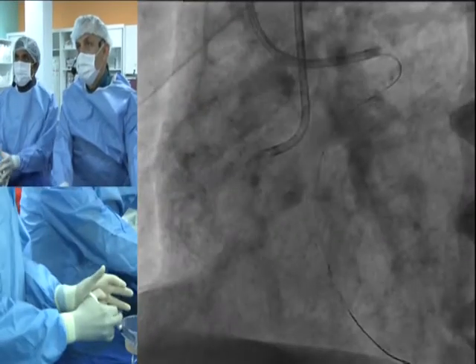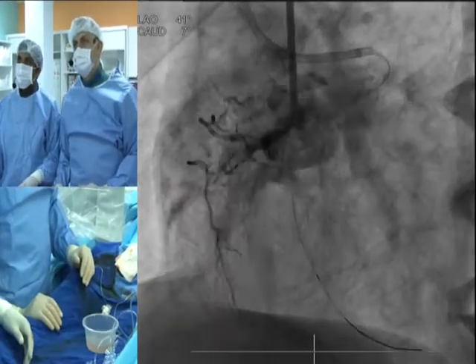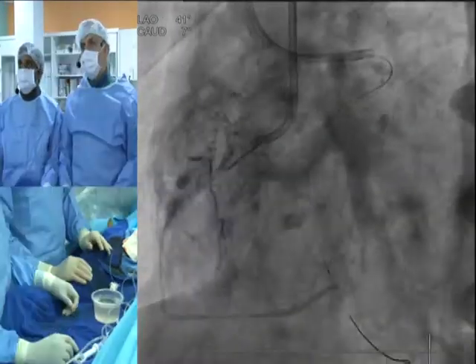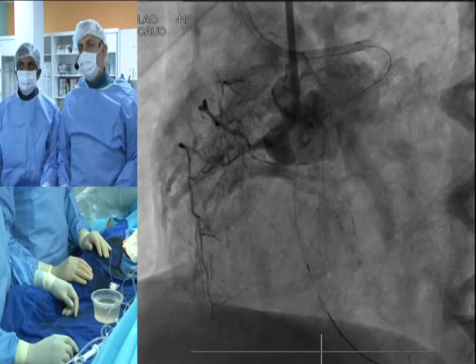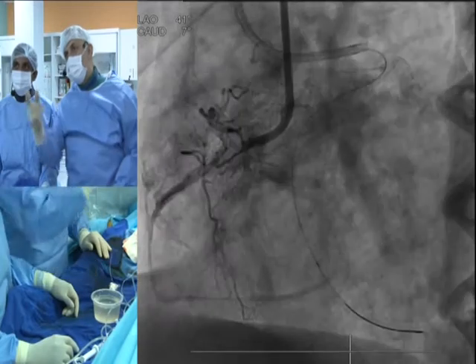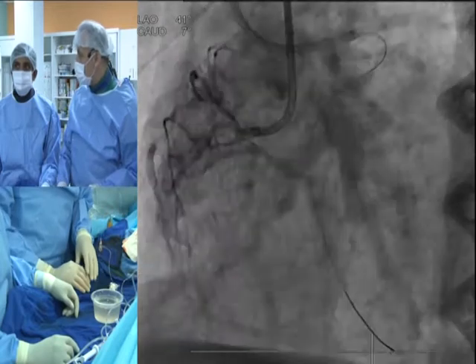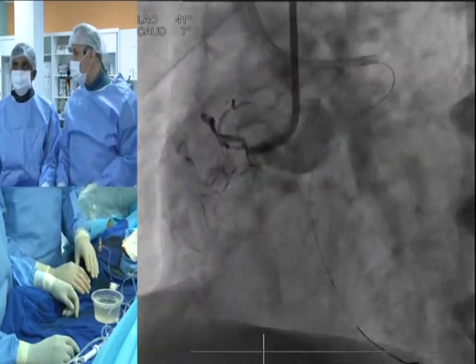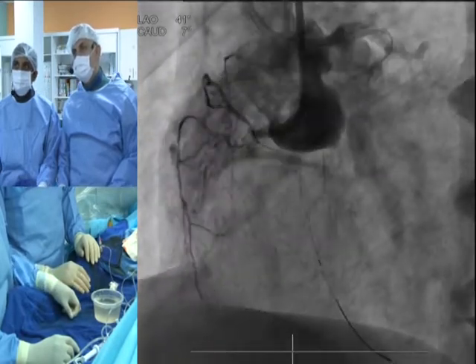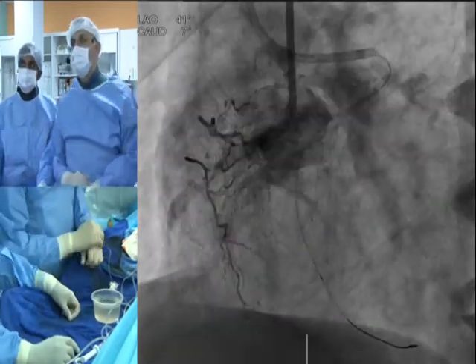Okay. So it's a short 15 millimeter, but ambiguous proximal cap. You see here, the right coronary is occluded at the proximal, and there is actually no antegrade flow. We see some vessel there, but I believe that is not right coronary, it's a vein. It's a venous filling. So do you agree with me? I completely agree. It's venous filling. We can see that it's draining into the coronary sinus. So there is actually no filling from the proximal to distal RCA.